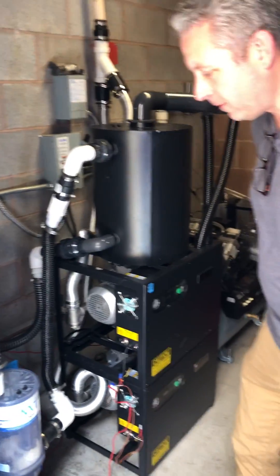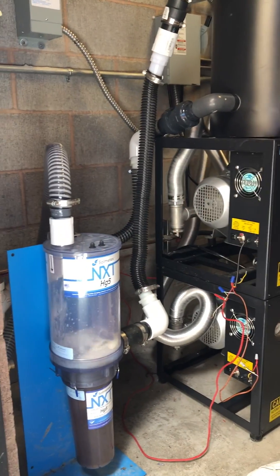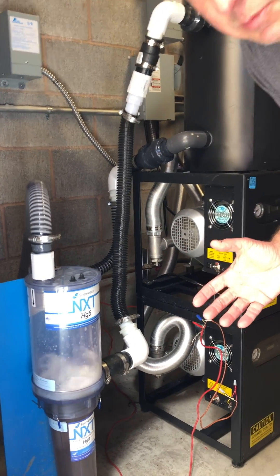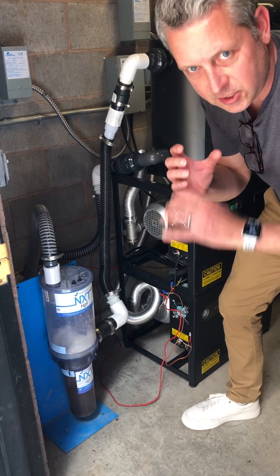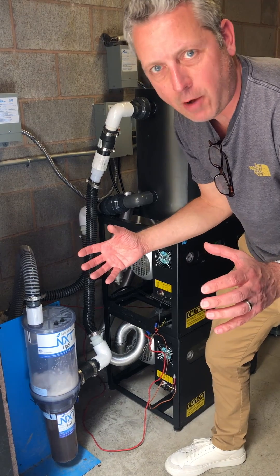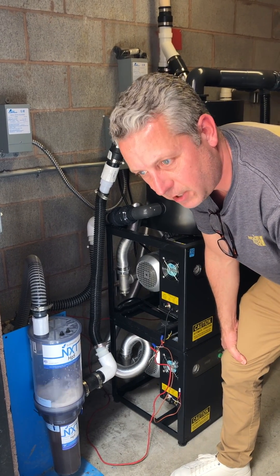First off, we installed a new amalgam separator. The old amalgam separator completely filled up within a couple of weeks after we installed the new vacuum system. That's pretty typical. A lot of times, as the vacuum system is failing in the office, the gook and stuff inside the lines will fill up over time. When we hook in the new vacuum system, the overall vacuum really sucks all that gook out of the lines, and you might see your amalgam separator fill up much more quickly than you would expect.